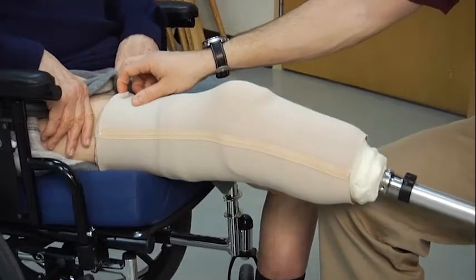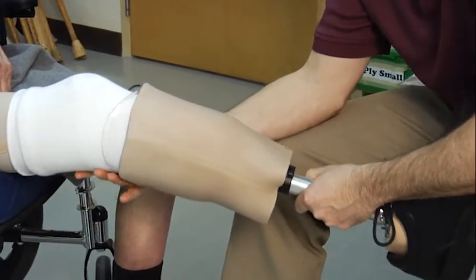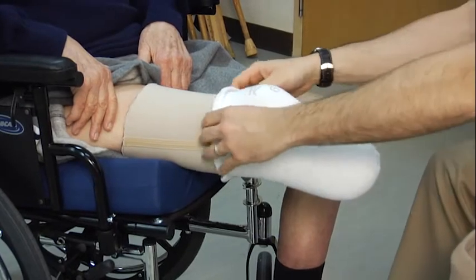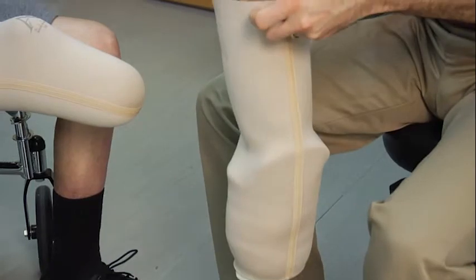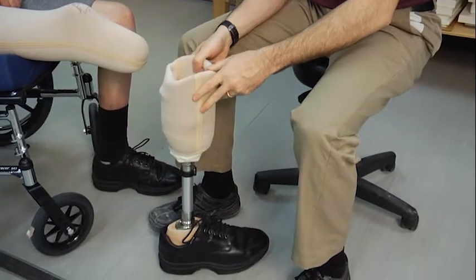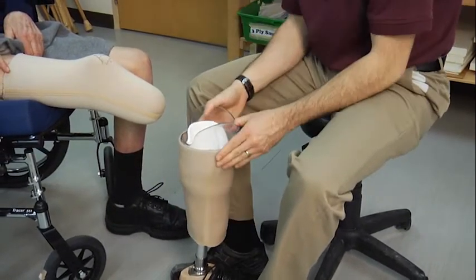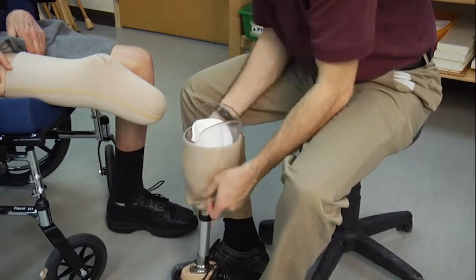When removing the leg, we can pull the sleeve down over the socket and then gently pull the leg off of the residual limb. The socks can come off and be placed into the socket for safe keeping. We then pull the sleeve up and tuck it into the prosthesis for storage. The reason for pulling the sleeve up is that if the gel is left exposed to air, it will dry out and crack, ruining the suspension sleeve.